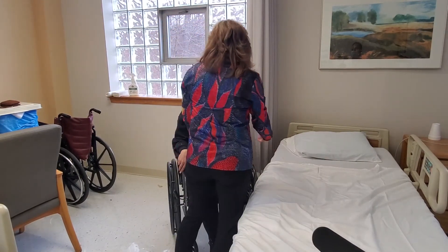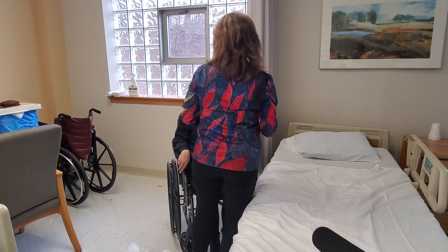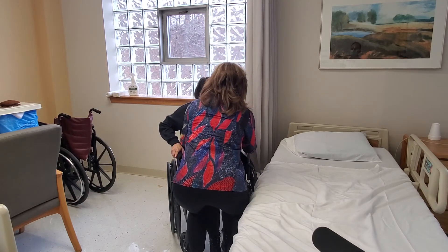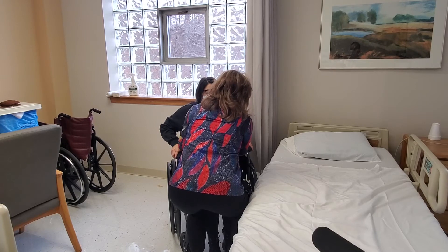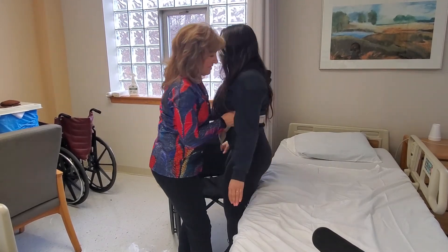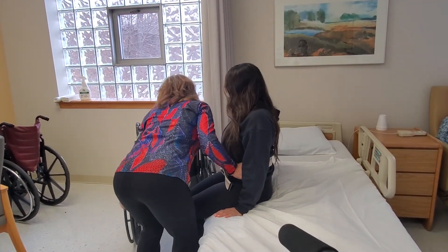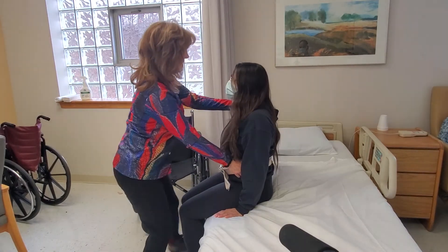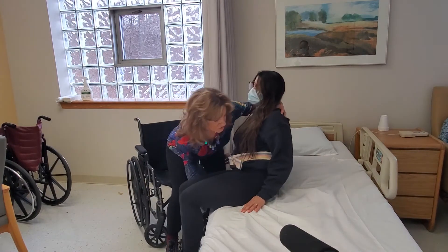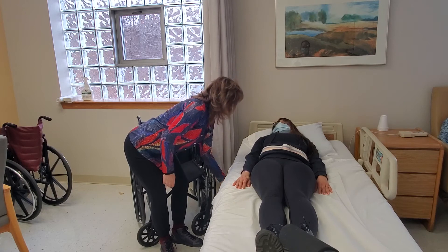Cassandra, we're going to reach over — first you're going to stand up holding onto the railings, and then we're going to get you to the bed. I'm straddling around her, she's holding on, I'm grabbing onto the grab belt. Come on, stand up — good job. Let's just turn you around and sit you down. Perfect. Hold onto your patient, push the chair away. Cassandra, we're going to lay down now — I'm going to give you a little adjust. There you go. Perfect. Make sure you put the railing up.